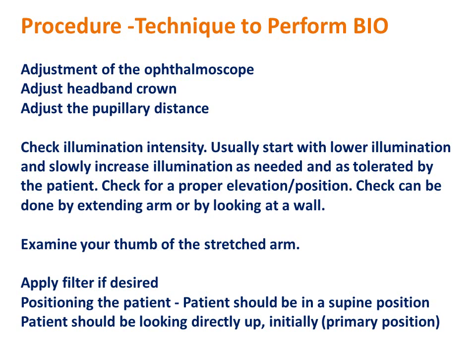Check the illumination intensity. Usually start with lower illumination. That is the rule for any ophthalmic equipment. Never ever start at a higher illumination, and you should not switch off the equipment when it is at higher illumination, because the next time when you switch on, suddenly the bulb may burn, and most of the bulbs are extremely costly. Hence usually start with lower illumination and slowly increase the illumination as needed and as tolerated by the patient.